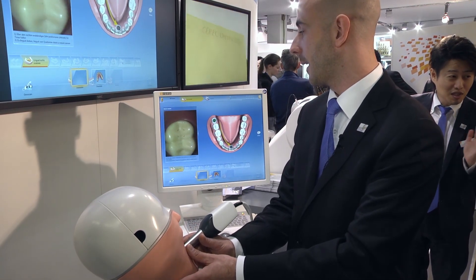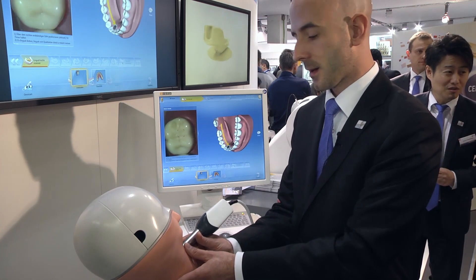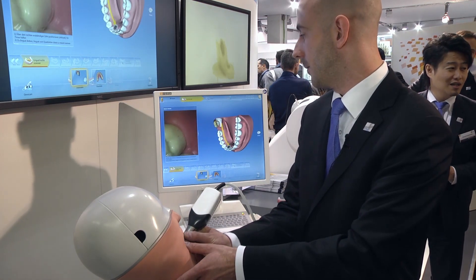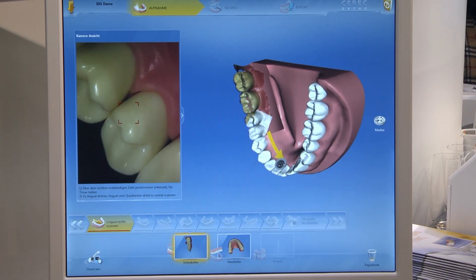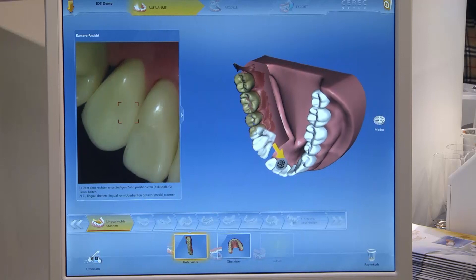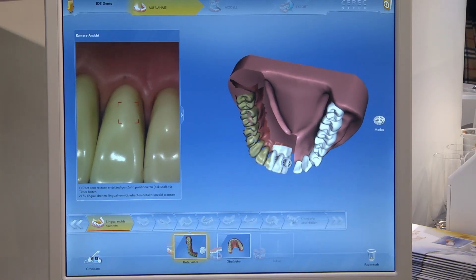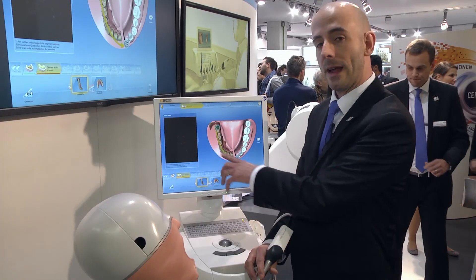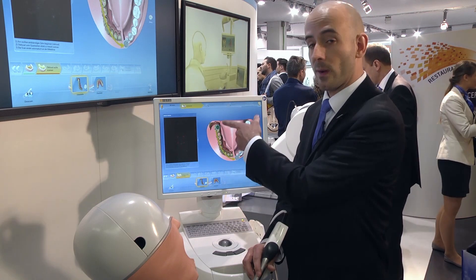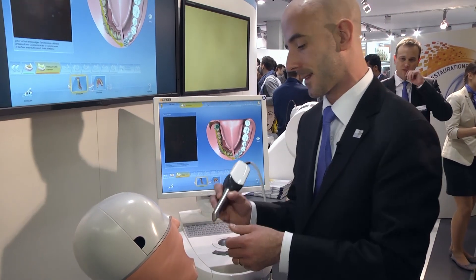We place the camera over the occlusal of the terminal molar here and scanning starts. We rotate to the lingual, and we see on the screen symbols showing us where to scan and also where the scan should end. Around the midline we end the scan of that first quadrant, and now the software has that first quadrant in place and will show us where to start with the camera — the screen symbol — and where to finish for the next scan step.